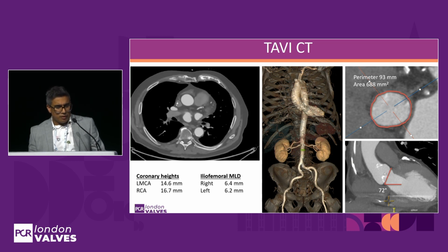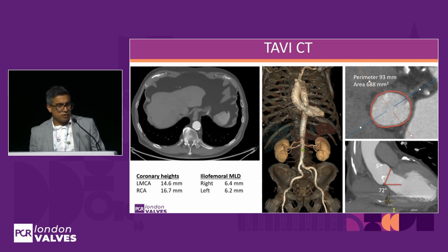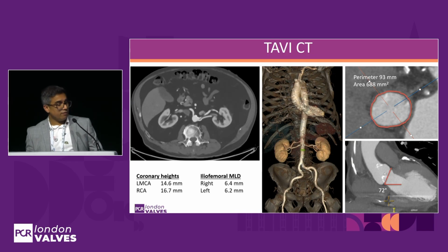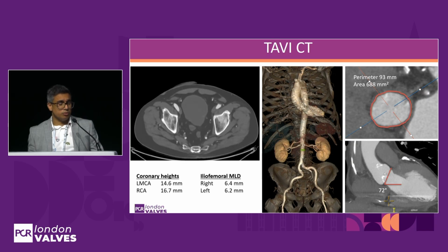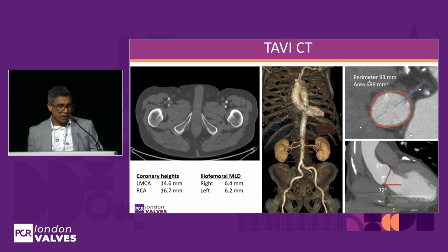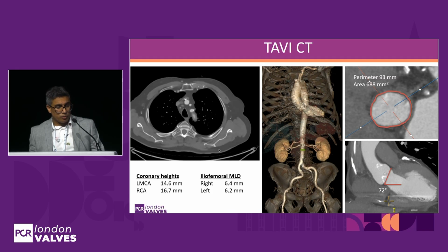This is his TAVI planning CT. Just looking at the video on the left-hand side, you can see there's no real challenges in terms of access. This would be suitable for most valve platforms. The left main coronary heights were all okay.